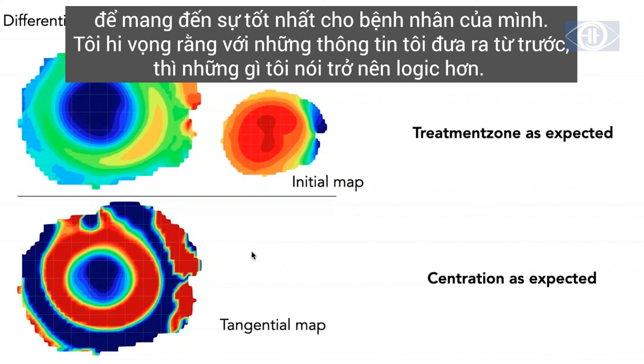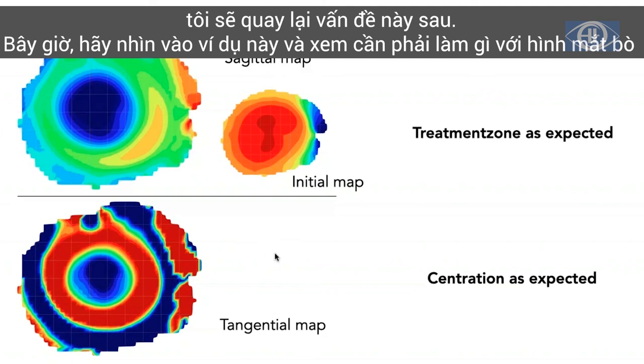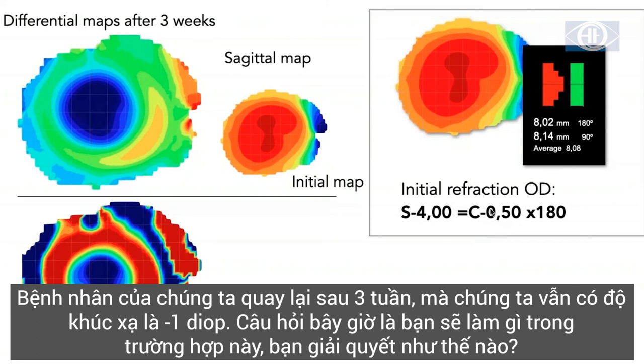But 2 weeks ago, when we finished our webinar about topography, there was a question about what to do if you have an over-refraction with Ortho K. And I promised I would come back to it. So let's take this example. We have to deal with the bullseye, but this is the situation in practice. We have an initial refraction of -4 with a cylinder of 0.5, but we see that back in our curvature as well. The patient comes back after 3 weeks, but we still end up with an over-refraction of -1 diopter. So we end up with a bullseye.